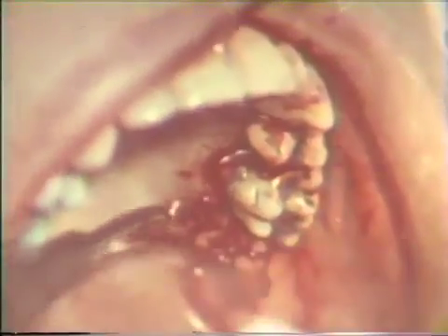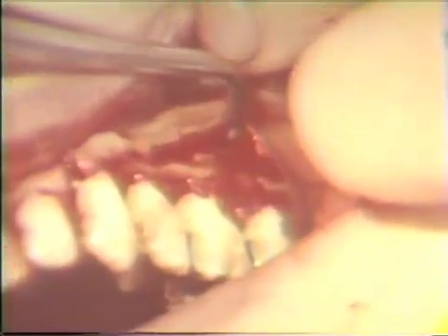The Barraquer is a convenient instrument to grasp and remove the excised wedge of tissue behind the second molar. The excised buccal tissues are treated the same as the palatal tissues. Note how the flap has been raised about four to five millimeters apically in order to expose the buccal edge of bone. The bone must not be allowed to become dry. All soft tissues over the bone should be removed with curettes. The flap and blood should be allowed to cover the bone as much as possible during this procedure in order to keep the surface bone alive.